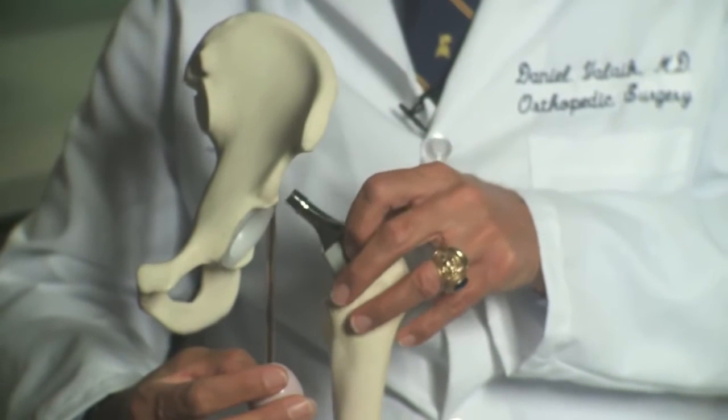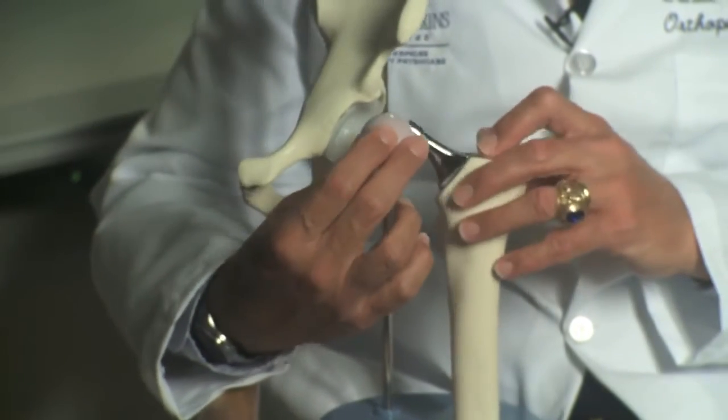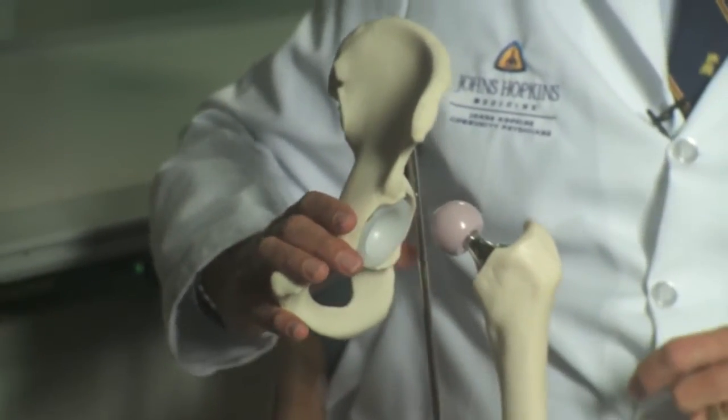If you think of a joint replacement, you can think of it in four pieces. The first is the femoral stem, which fits inside the femur or the thigh bone. You can have a metal femoral head or a ceramic femoral head — that fits on the femoral stem. And then two components fit in the acetabulum, or the socket of the hip.